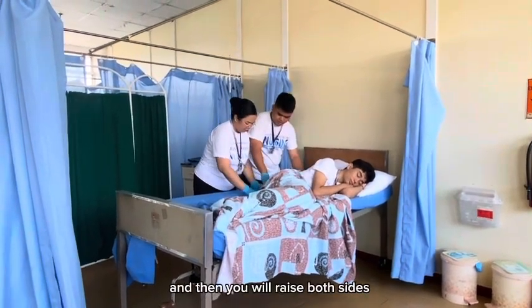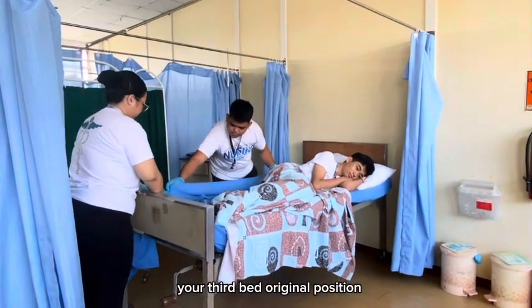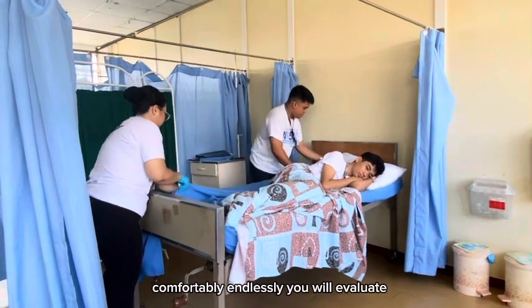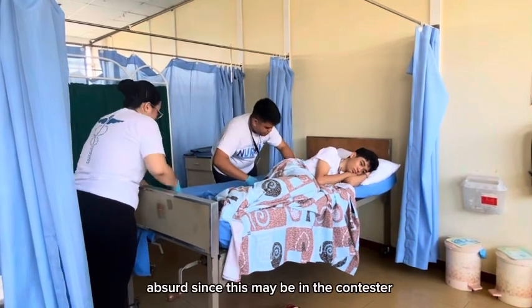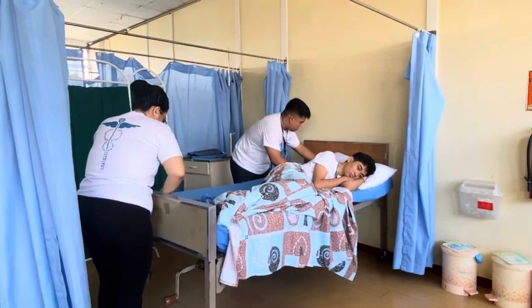And then you will raise both side rails for client safety, and return the bed to its original position according to the physician's request or patient's comfortability. And lastly, you will evaluate the patient's needs and document any unusual circumstances observed, since this may be indicative of any underlying unnoticed sickness.